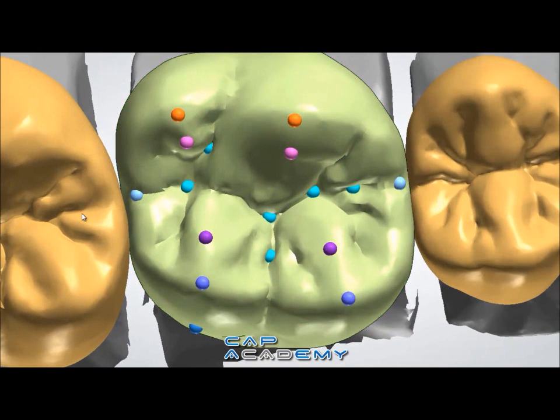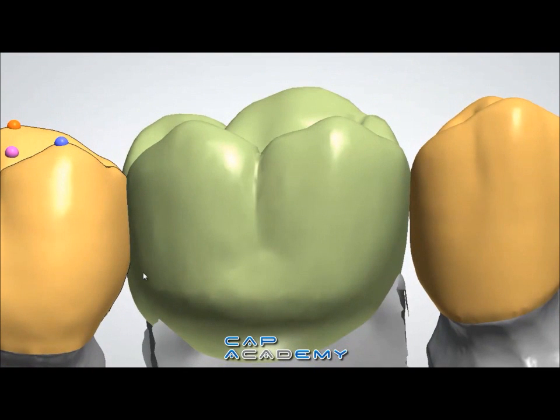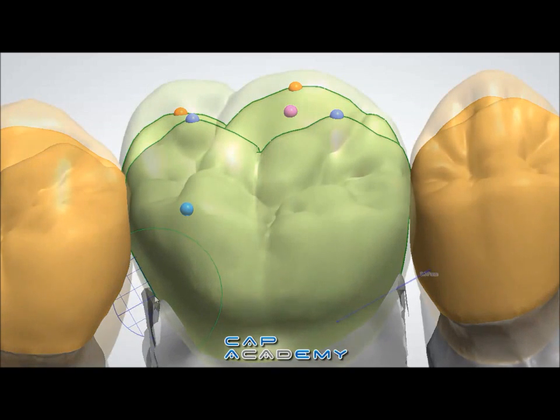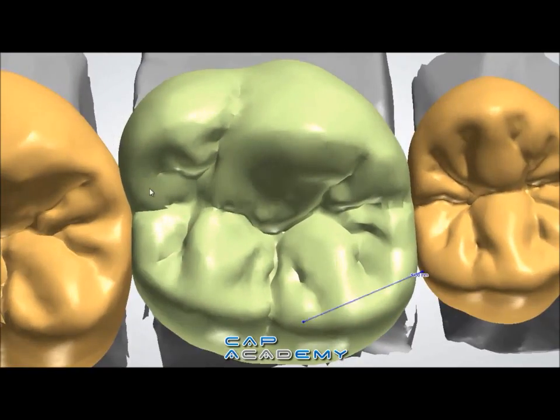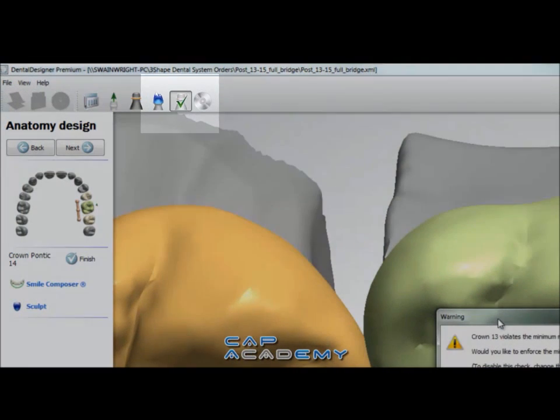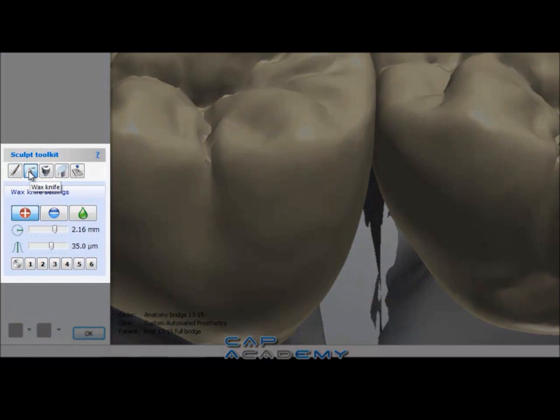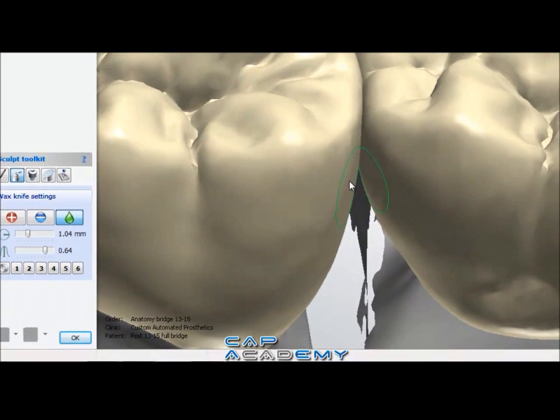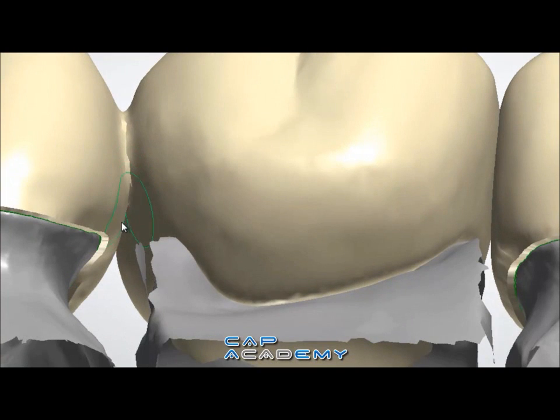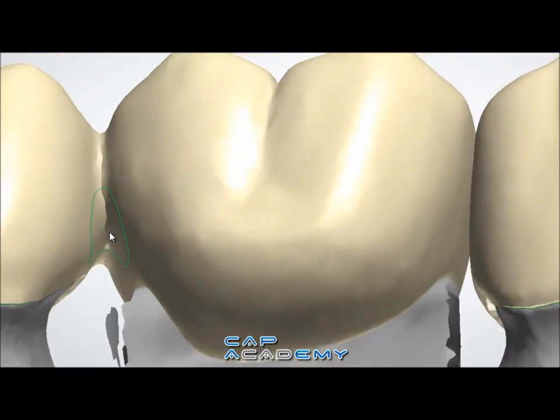Don't worry about making the connection too large at this stage. In the next step when it finalizes, you'll see it's much easier to make it a thicker, broader contact and a thicker connection. In finalize is actually when it takes the three restorations and fuses them all together into a single fused piece. Now let's take our wax knife tool — I like strong on the strength and a small diameter. You just go around the bridge connector, and since they are fused together, it'll just pop out with that smooth tool.